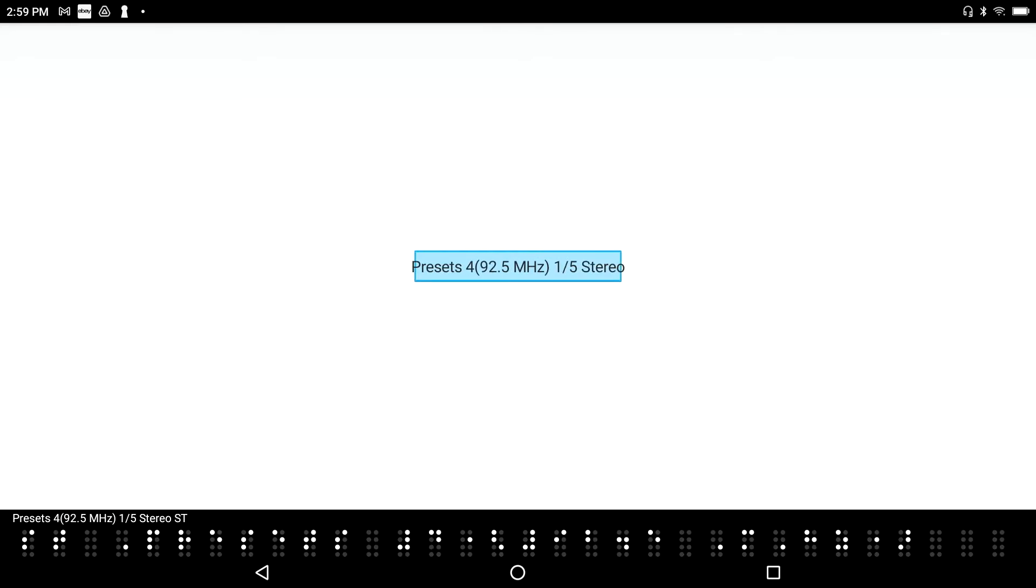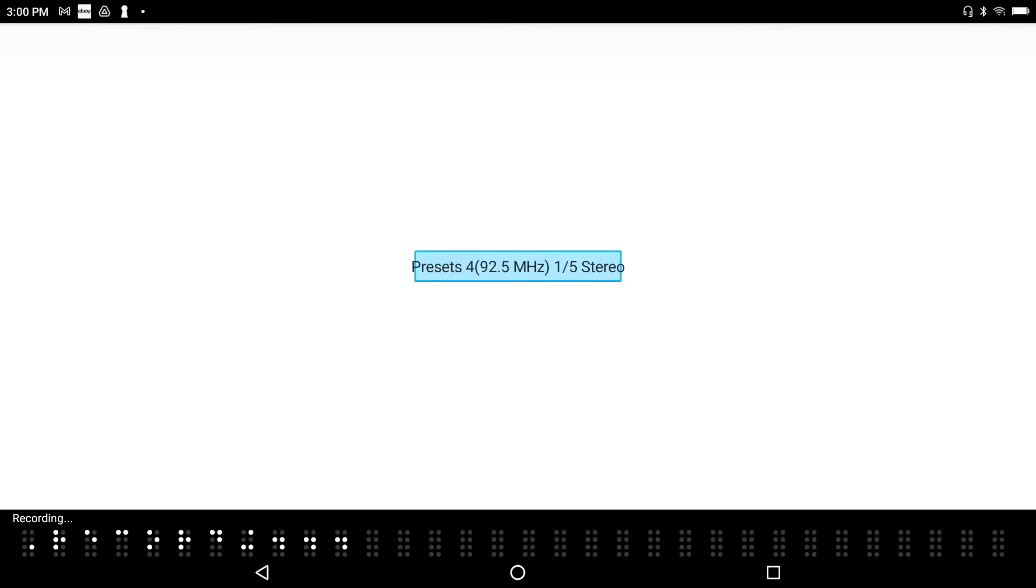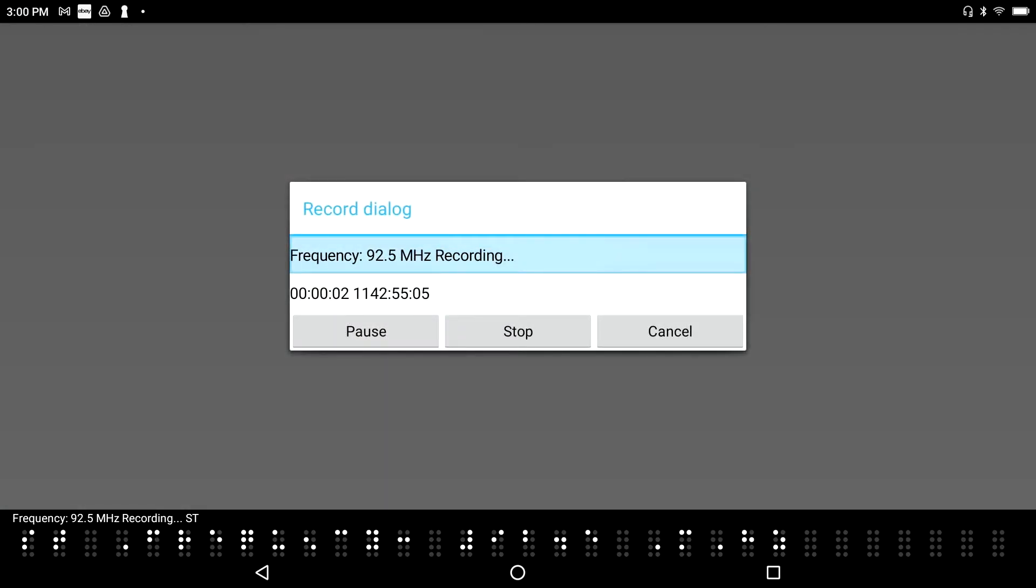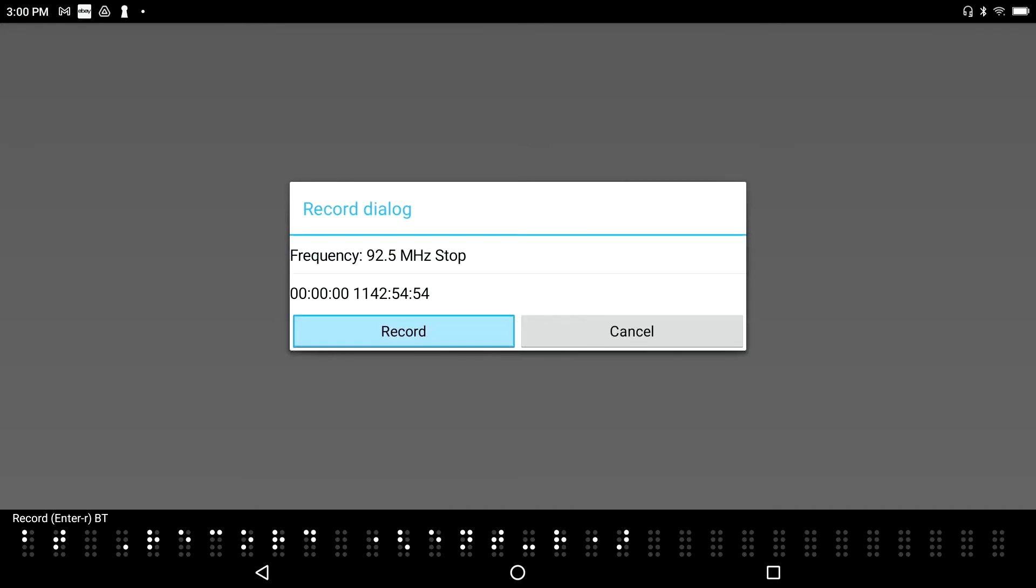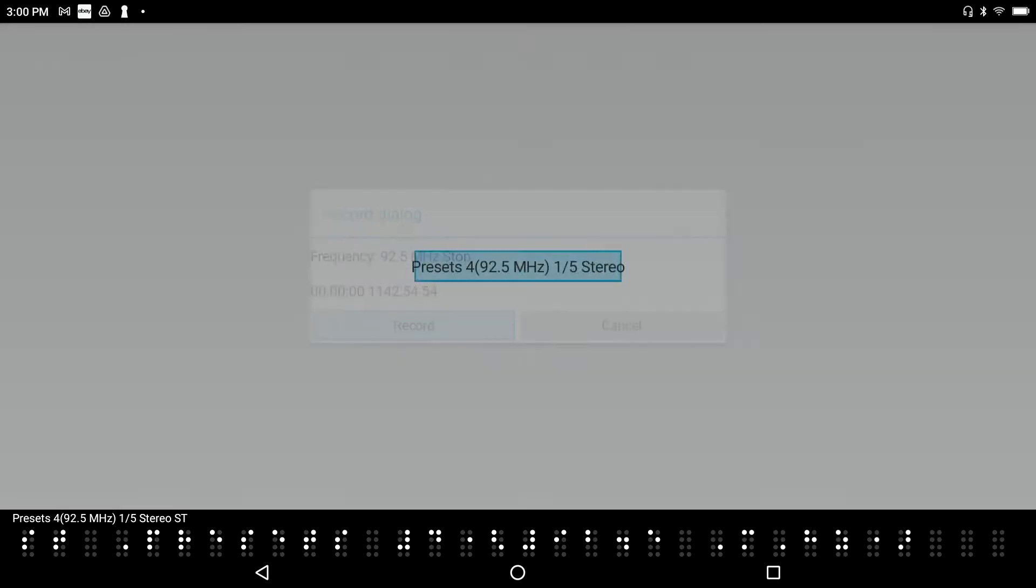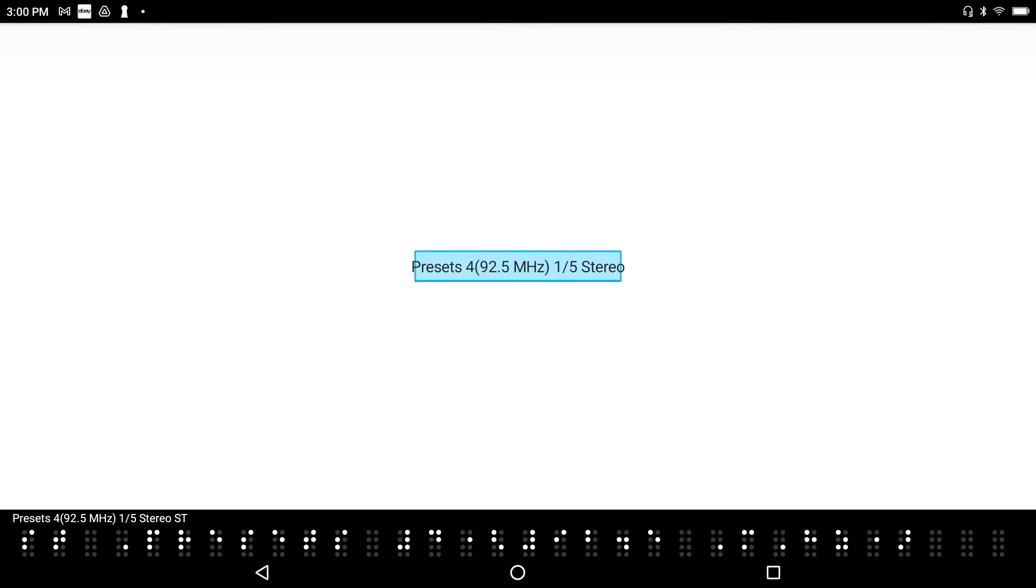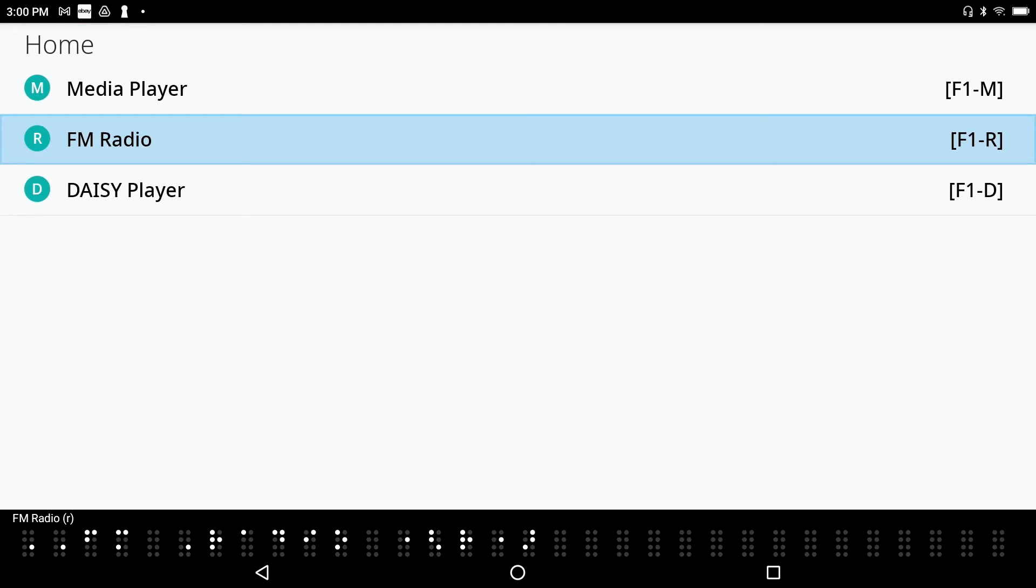And now I can actually browse my presets just by pressing .4 and .1. Preset 4, 92.5 megahertz, stereo static box. Okay, so that's the radio. If I want to record, I can just say... I'm going to go ahead and press Enter R. Record dialog. Recording. Frequency, 92.5 megahertz. Recording. Static box. And I am recording. I'll stop the recording. Stop. Record. Enter R. Okay. And I'm just going to go ahead and bail out of this. Preset 4, 92.5 megahertz. And I'm going to go ahead and get out of the radio altogether. FM Radio.